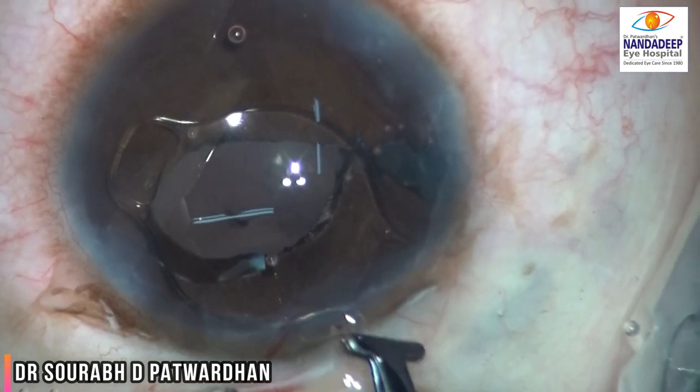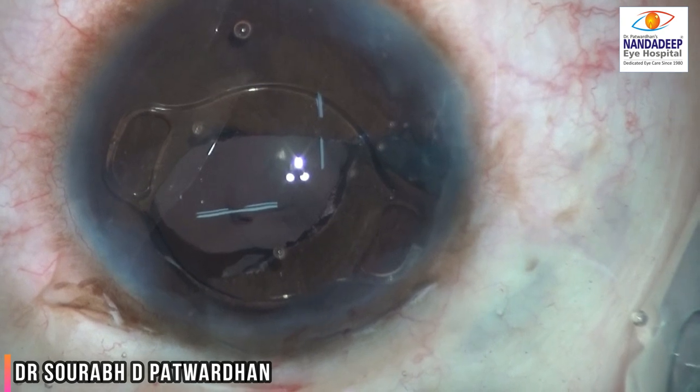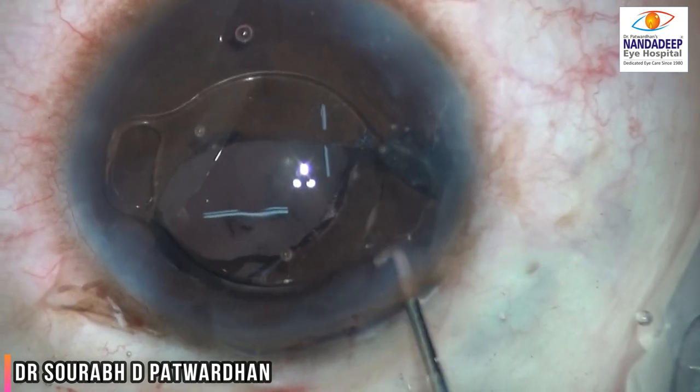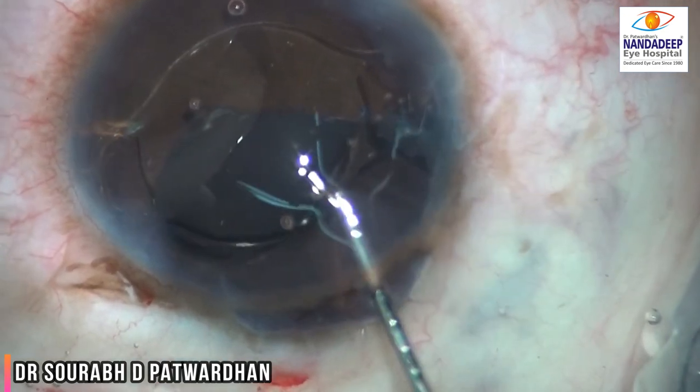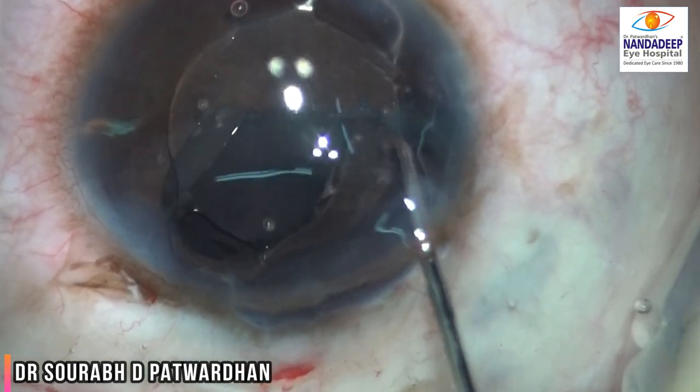The iris claw lens is now in the anterior chamber. You can realize how small the globe is, because the entire diameter of the IOL is 8 millimeters and the central optic is around 5 to 5.5 millimeters. So you can realize that the size of the cornea is really small here.